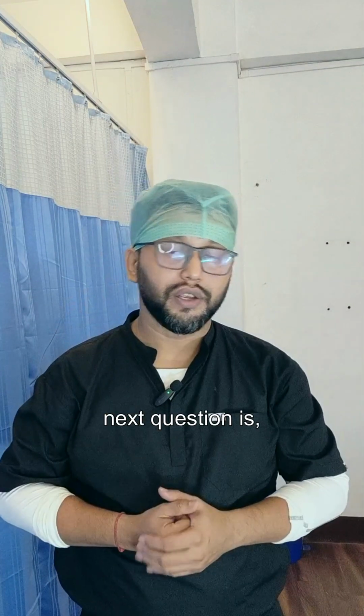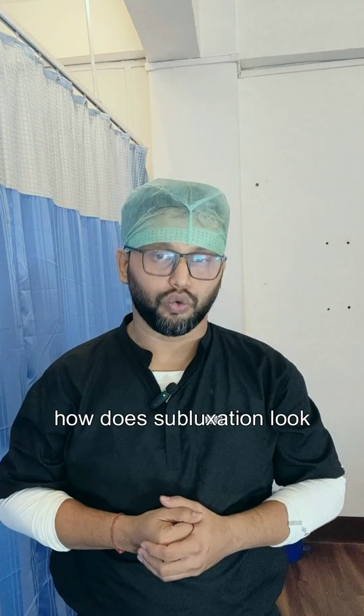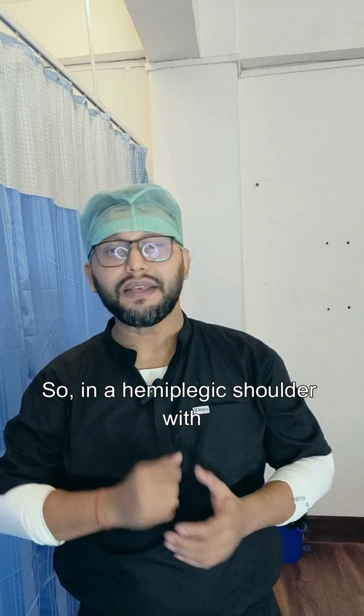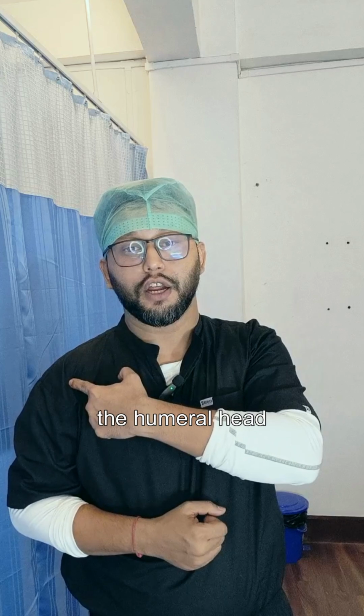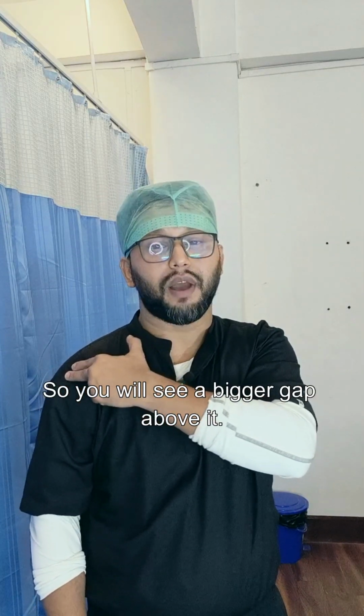Now the next question is, how does subluxation look in an X-ray? In a hemiplegic shoulder with subluxation, the humeral head drops downward, so you will see a bigger gap above it.